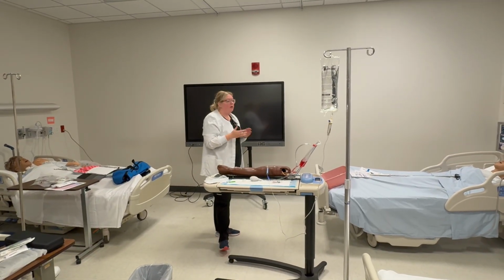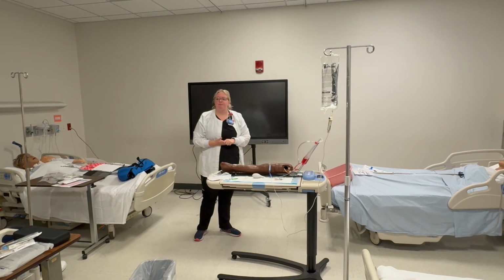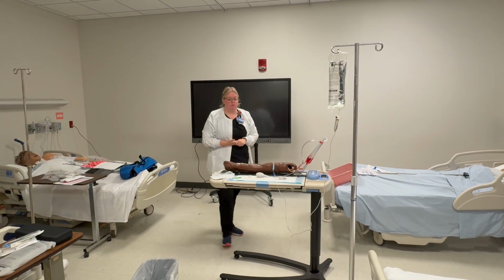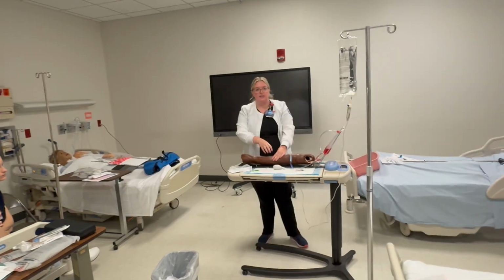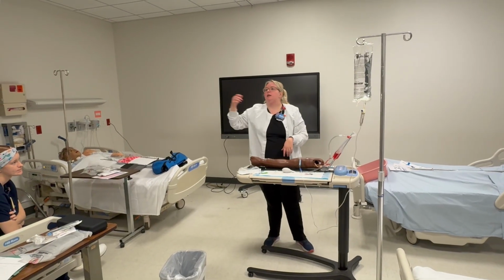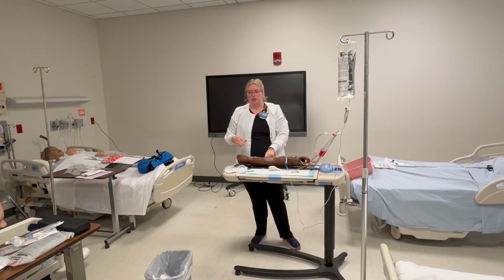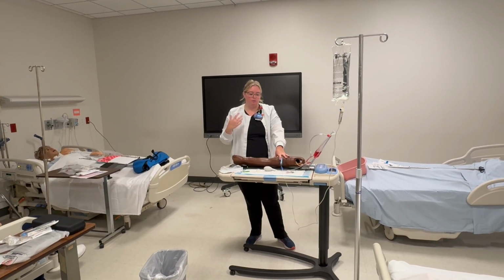All right, what if it wasn't flowing? What would you do? Check the IV's patency with a flush. Yep, you can disconnect it, make sure it's flushing. I wanna look at the site, make sure the site isn't puffing up. Maybe while you're setting it up, the patient dragged it on something. You never know. So you're watching it flow here, but I'm also watching my site, asking the patient, everything feeling okay? Any pain there? Nope, okay.